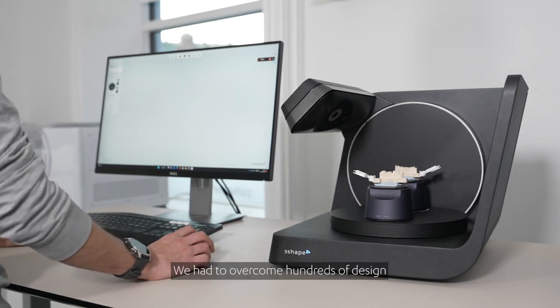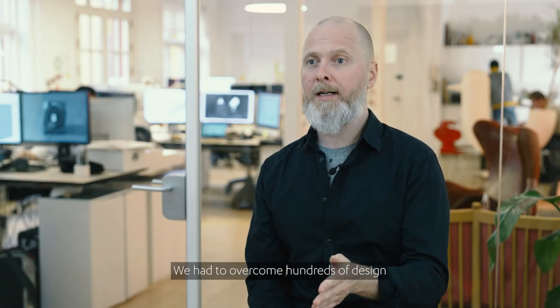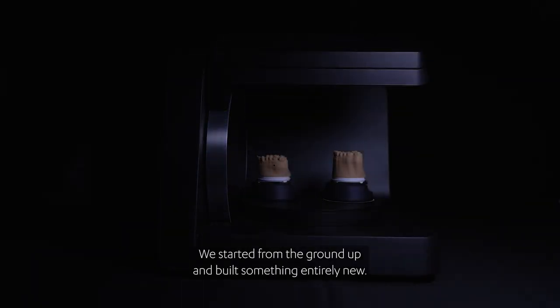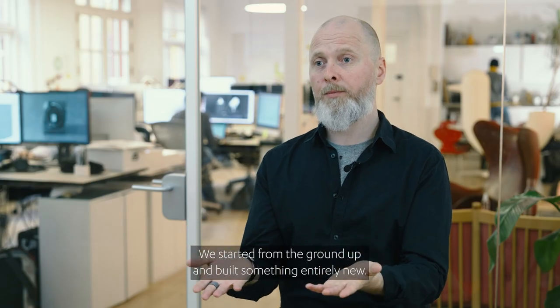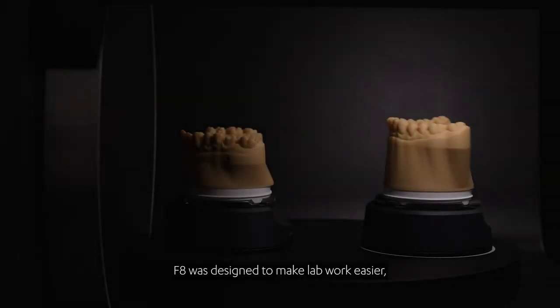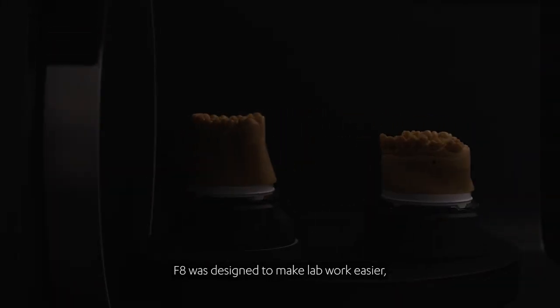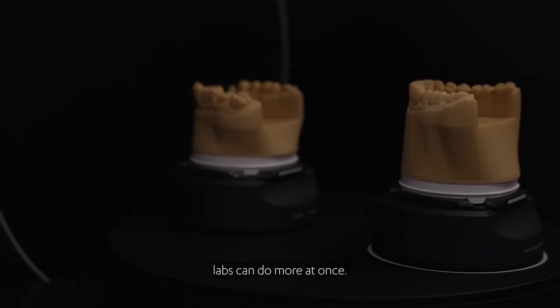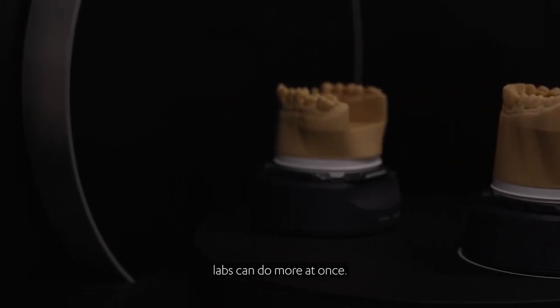We had to overcome hundreds of design and engineering challenges to create F8. We started from the ground up and built something entirely new. F8 was designed to make lab work easier. The form comes directly from the function. The intuitive place and scan design means labs can do more at once.